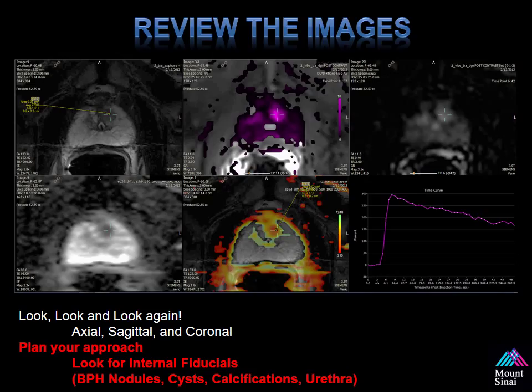It's always important to review the images before you perform a fusion biopsy. You need to look, look, and look again. It's always important to review the axial, sagittal, and coronal views. This allows you to plan your approach. You can also look for internal fiducials to improve your registration — BPH nodules, cysts, calcifications, and the urethra.